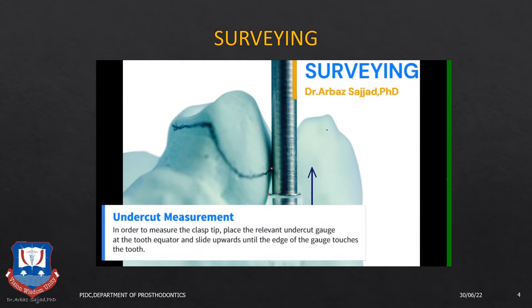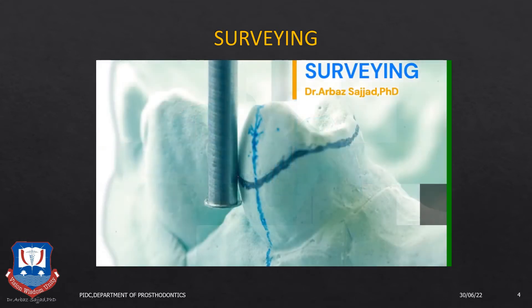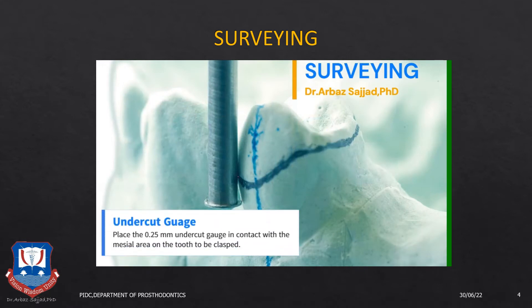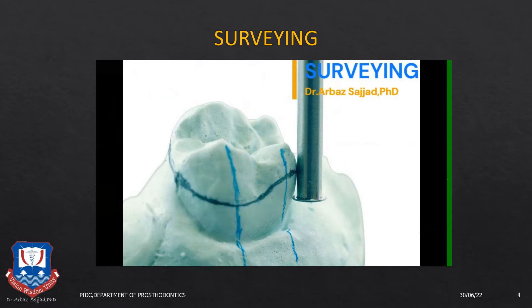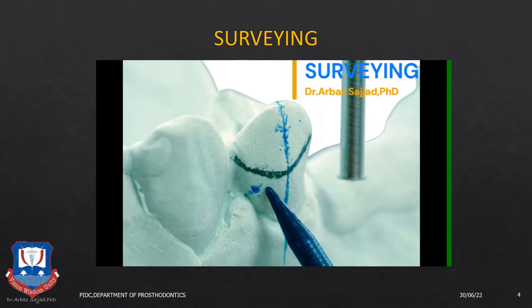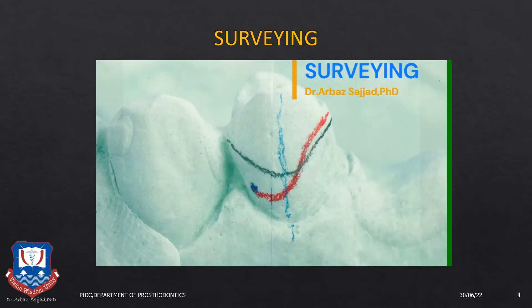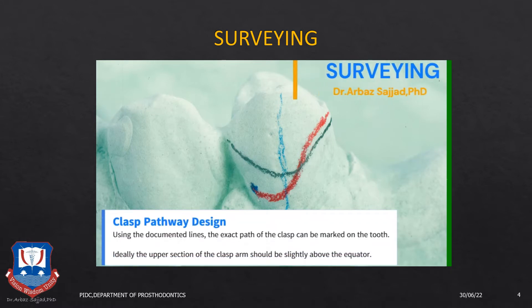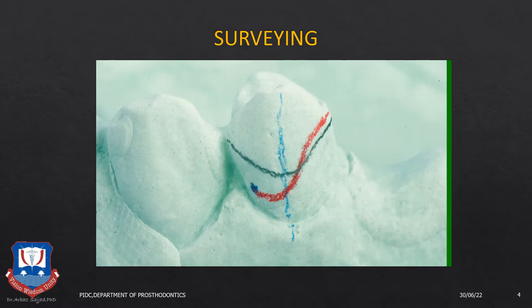The first step in RPD designing or designing for a CPD is the surveying. In surveying, the undercuts are first measured to decide which type of clasp tip or clasp assembly you're going to give. Usually for a cast partial design, undercuts of 0.25 mm are sufficient to provide cast assemblies. The maximum height of contour of the tooth is marked, followed by designing of the path of insertion where the clasp is going to engage the undercut and cross over the maximum convexity of the tooth on the abutment teeth.